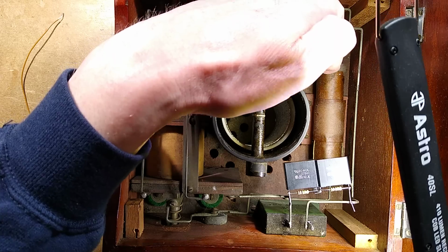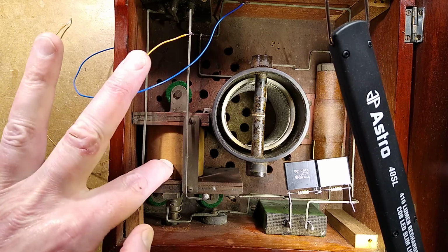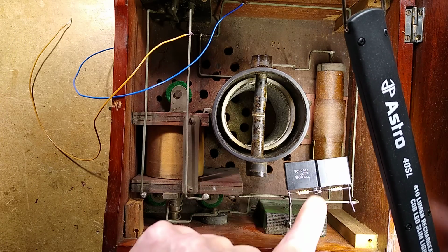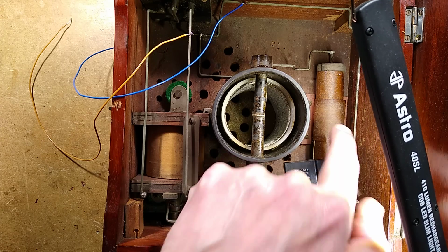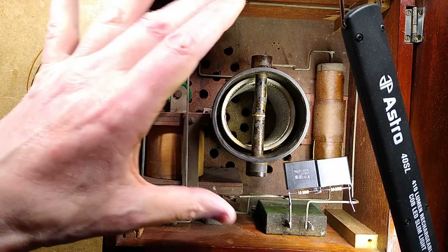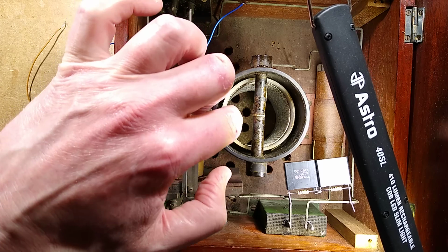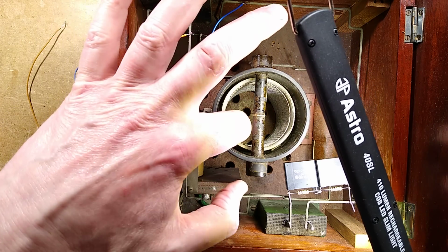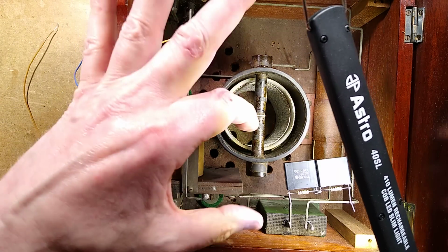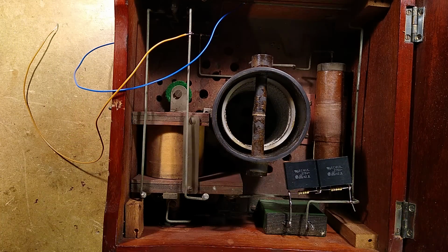This is the interesting bit because it is very high voltage. And then when the contact closes again, it doesn't just energize this, but it shunts that circuit that had been charged up and produces a high current pulse through the primary of that transformer that then creates a high voltage between an outer metal mesh, a kind of glass material cylinder, and then the inner metal mesh, which is connected with these insulators to keep it all away and avoid it sparking across, but it does still spark across.